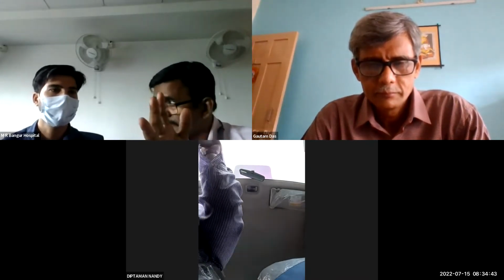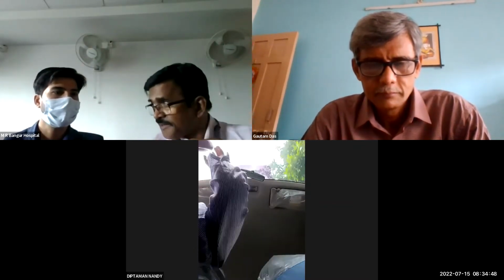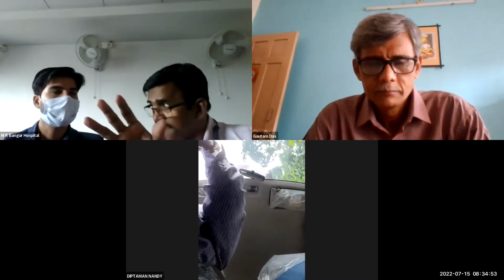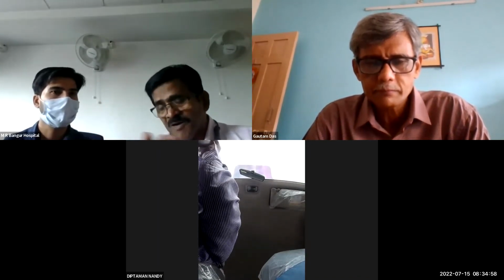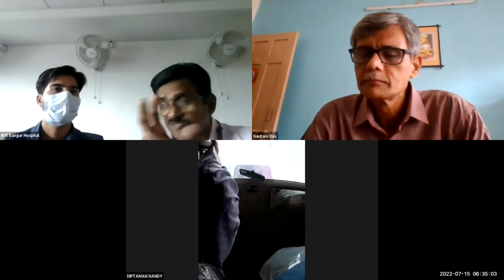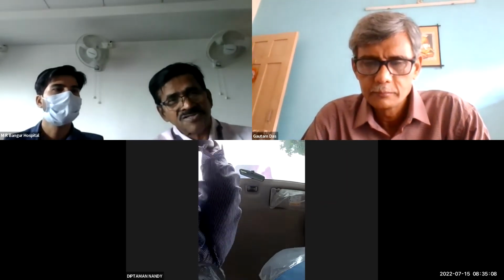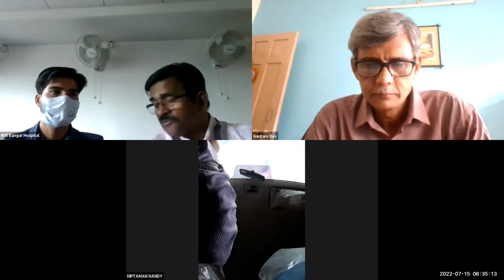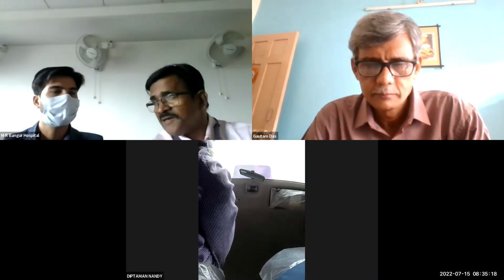You may not see the gallbladder, as you have not made the other ports. But what you can see is the remaining peritoneal cavity. You can see the liver, part of the stomach, part of the small gut. But thorough exploration is not easily done while doing a routine cholecystectomy, because you have a radiological diagnosis. Your target area is the right hypochondrial region. So no one does every routine examination, because you already have a USG of the abdomen.